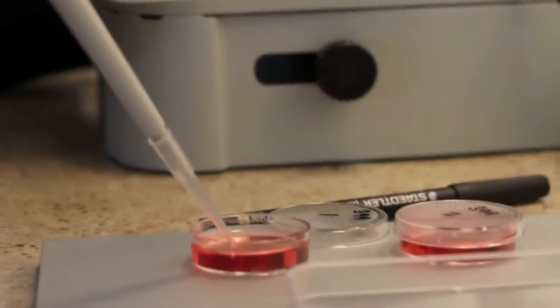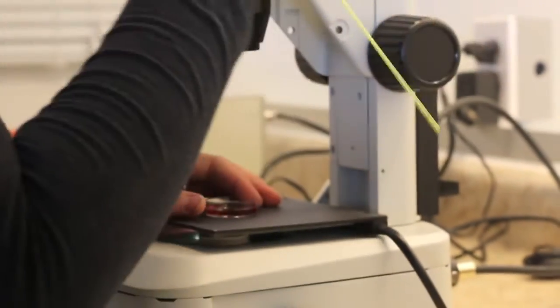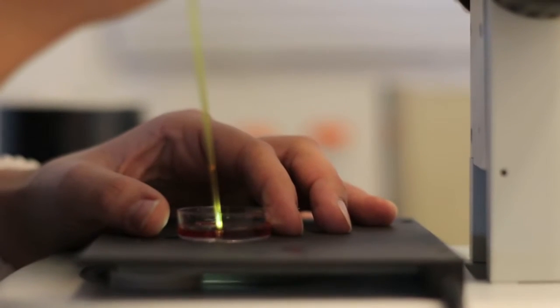The oocytes are placed in an incubator and driven to the Bovitech laboratory in Madison, Wisconsin. This is done exclusively by a Stateline Veterinary Service employee. A week later, embryos are ready to be either transferred fresh or frozen for future transfer or sale.